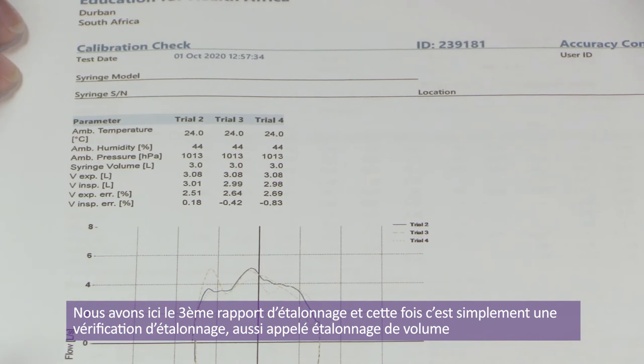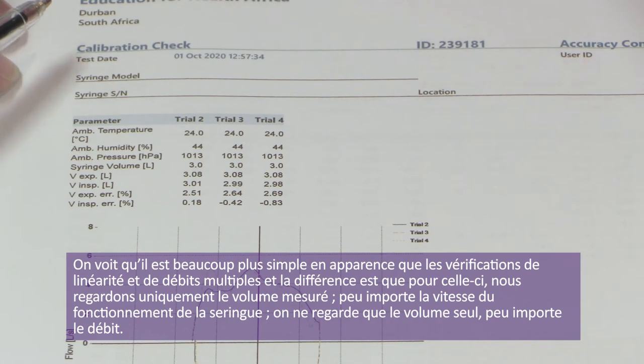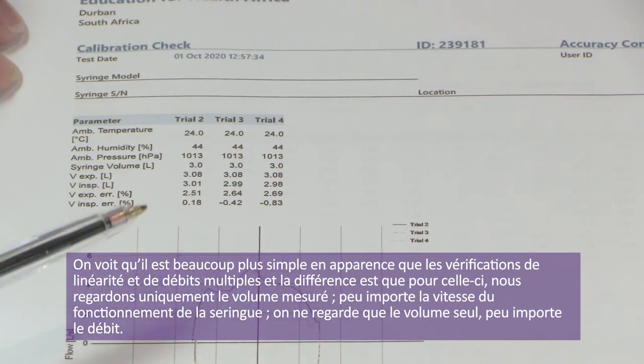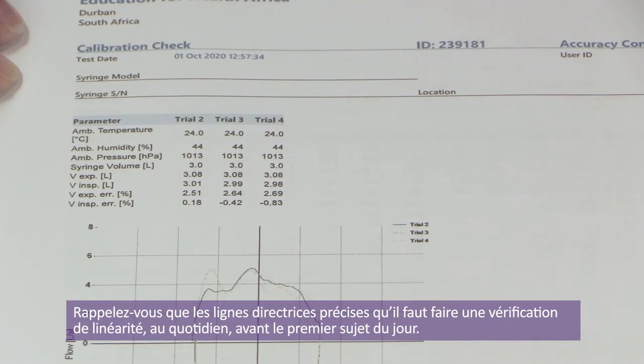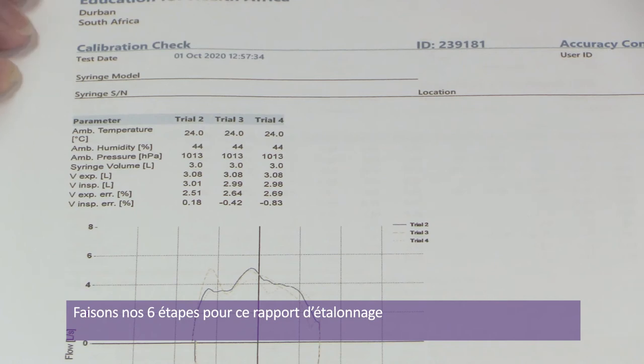We have a third calibration report — a straightforward calibration check, another name just for a volume calibration. You can see it looks a lot simpler than the linearity and multi-flow calibrations. The difference is that we're really just looking at the measured volume; it doesn't matter how fast or slow you move your syringe. The guidelines say you need to be doing a linearity calibration check daily before the first patient of the day.